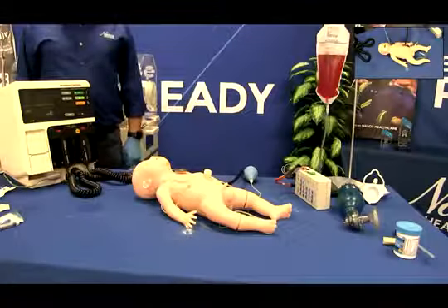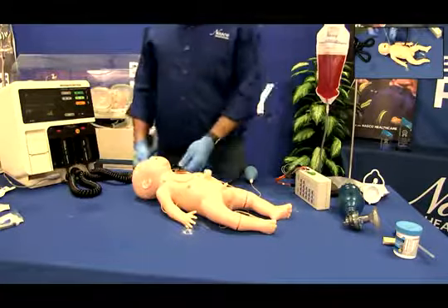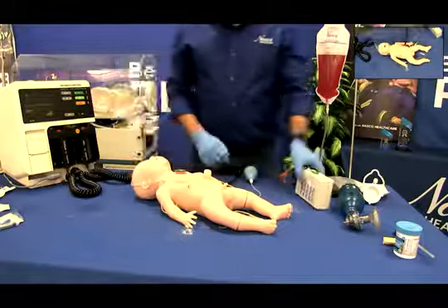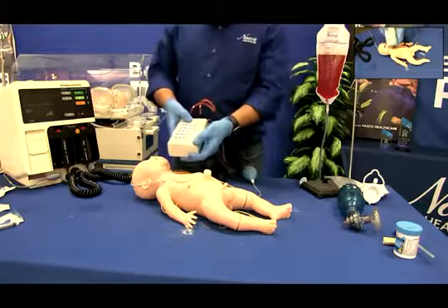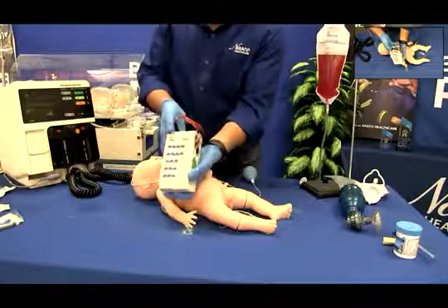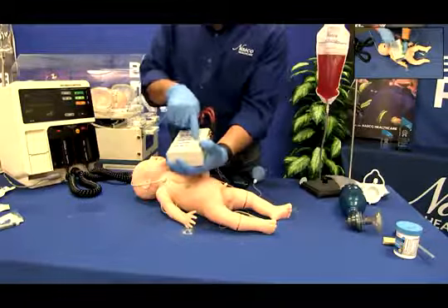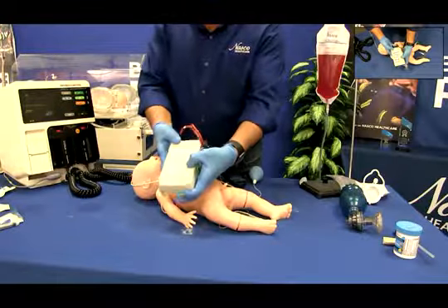Practicing CPR and defibrillation. Once you have set up and connected C.H.A.R.L.I.E to the Interactive ECG Simulator, you will turn on the Interactive ECG Simulator by pressing the on-off button. When turning on the ECG Simulator, the default selections are the adult age group and normal sinus rhythm. Press the age group button to select pediatric rhythms.